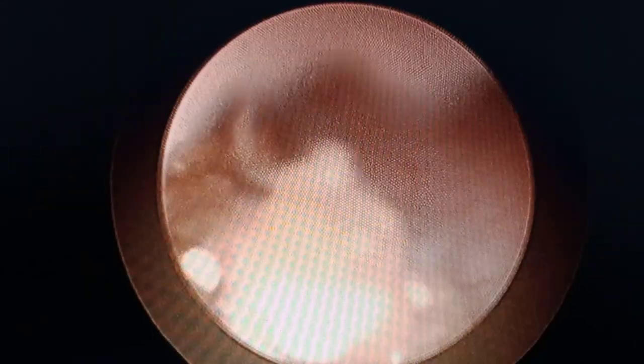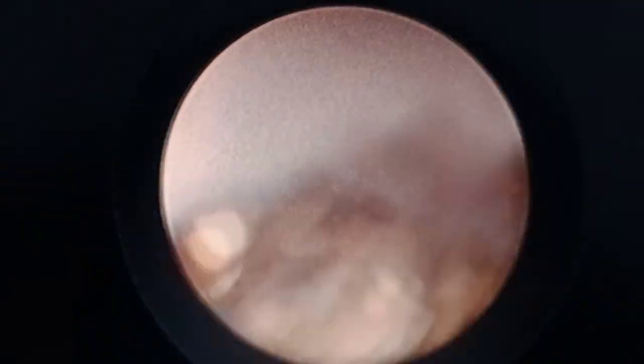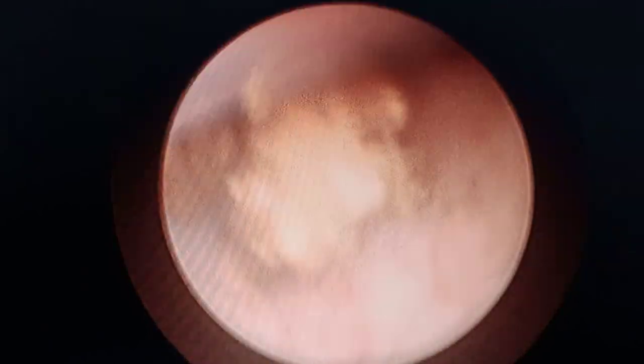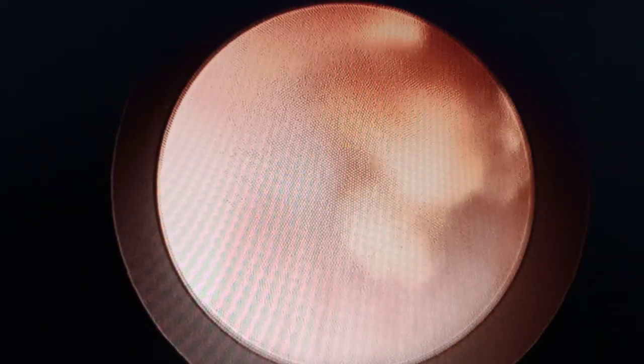In order to manage this, I advise you to place your probe slightly at an angle — let's say 5 to 10 degrees — with the stone. It is not going to affect the breaking function of the probe, but yes it will prevent the stone from moving up. Here you can see now smaller fragments are there; just place the probe over the stone slightly in an oblique manner, 5 to 10 degrees, so that it will prevent the stone from going up.